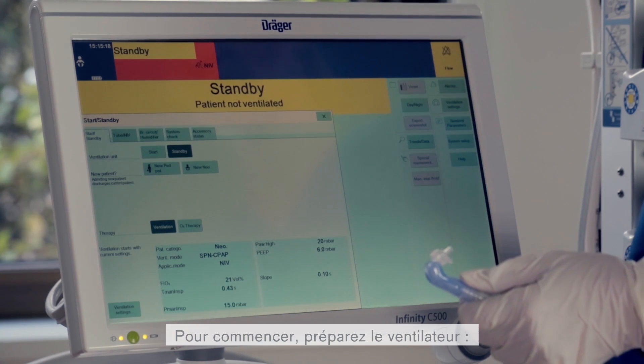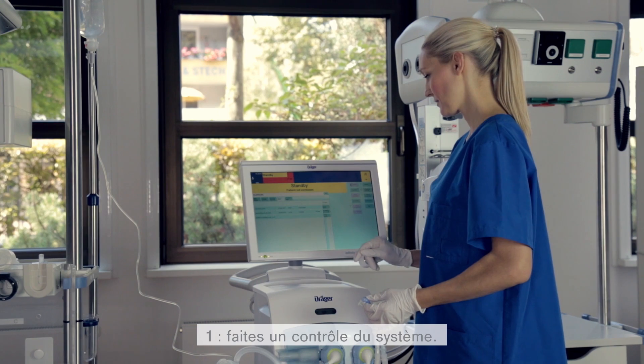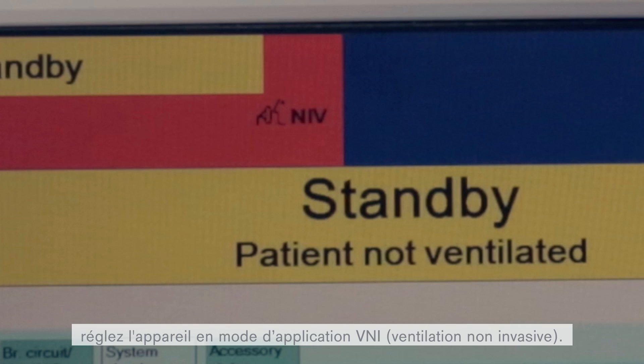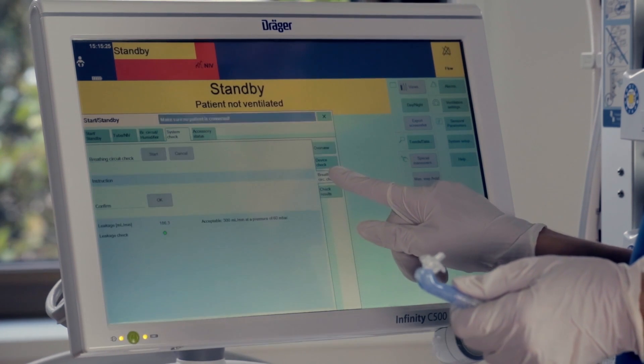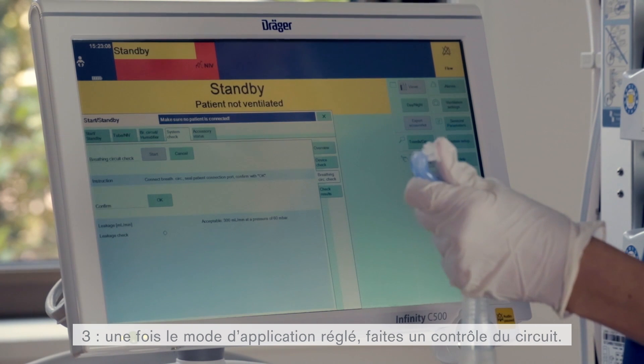To begin, prepare the ventilator for use. First, perform a system check. If the system passes the check, then set the device for use in NIV, non-invasive ventilation mode. Once the mode is set, then perform the ventilator circuit check.